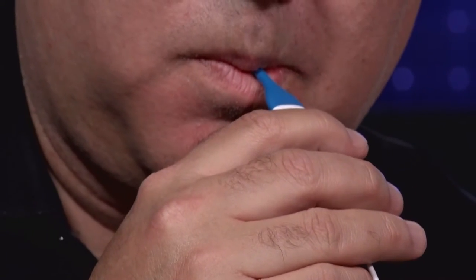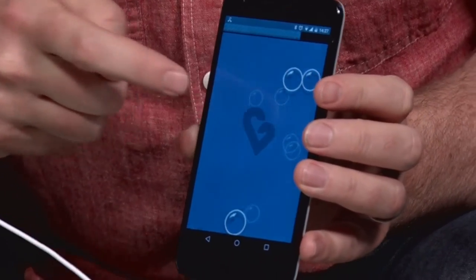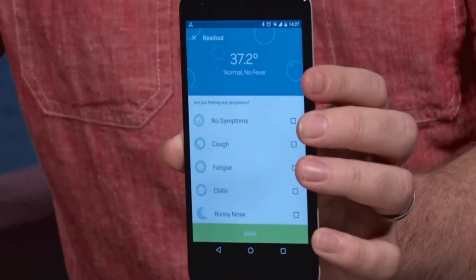What I liked about this app is that it's just really simple. While it's waiting to take the temperature, your little kids can play 'pop the bubbles' — just pop, pop, pop. And then once it's done taking the temperature, it gives back the results. 37.2 — totally normal, no fever.